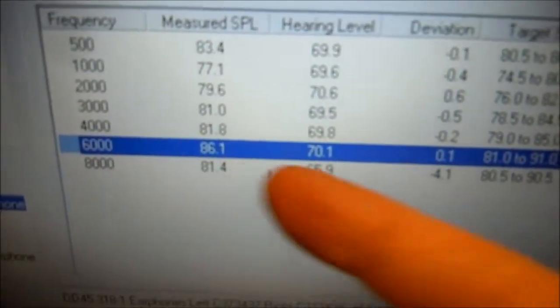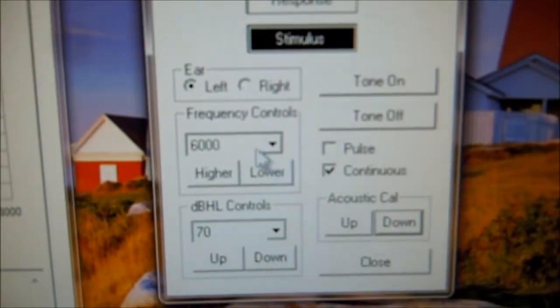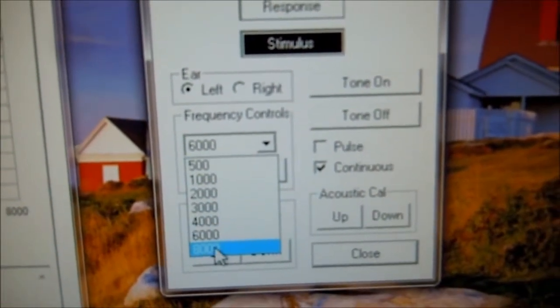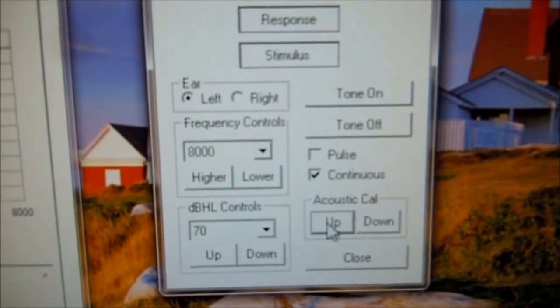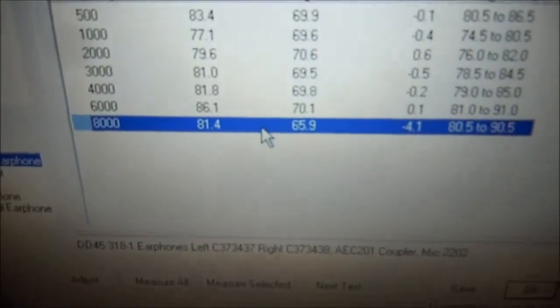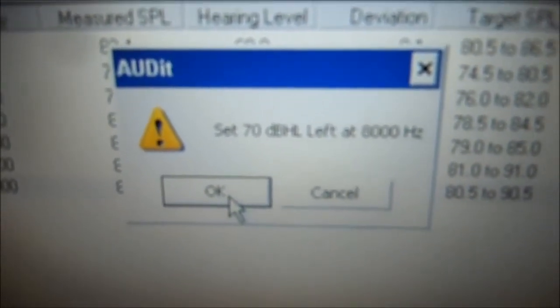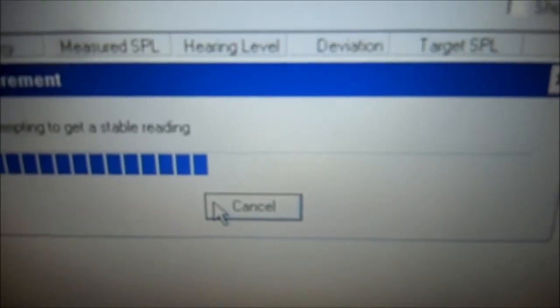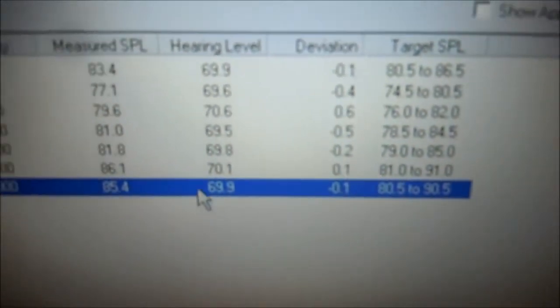And we're going to do the same thing for 8,000, which is negative 4. Select 8,000 — negative 4. Come back to the audiometer software, select 8,000, and because it was negative 4 we're going to go up 4: 1, 2, 3, 4. Come back to the audit software, make sure 8,000 is selected, click measure selected. It says set 70 dB at 8,000 — we've done that, click OK. Now it's all near zero and it's properly calibrated.